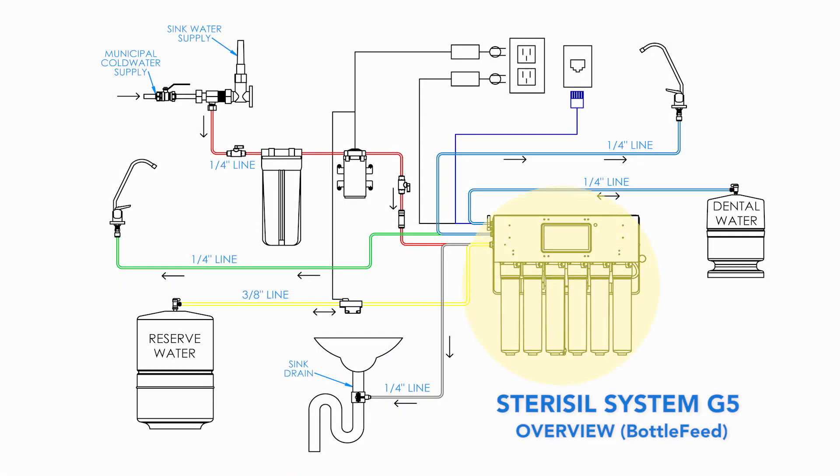In this section, we'll go over mounting the system, optional pre-filter, optional booster pump, water storage tanks, power adapter, and faucets. All external components like tanks, faucets, and drains should be positioned no more than 50 feet from the system to maintain consistent water pressure during use.